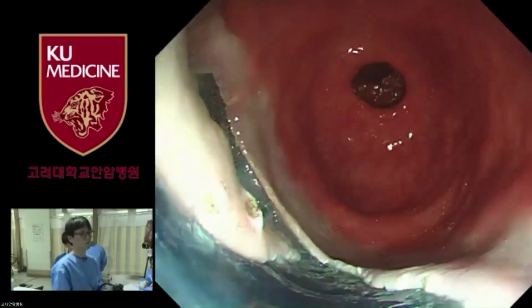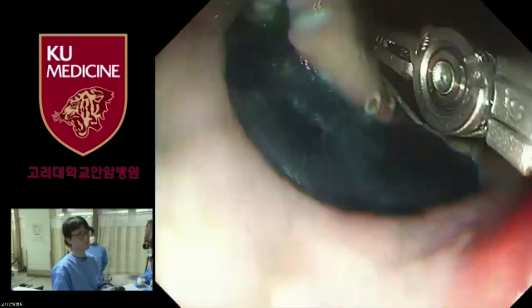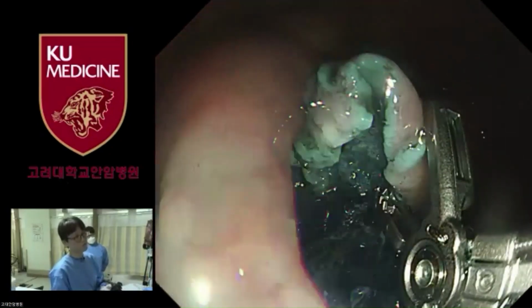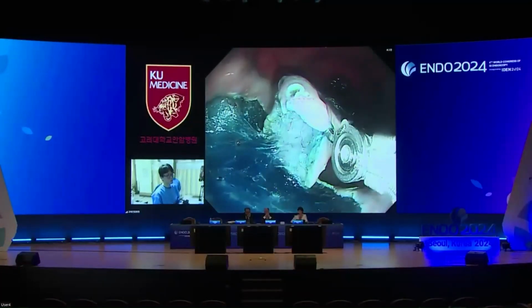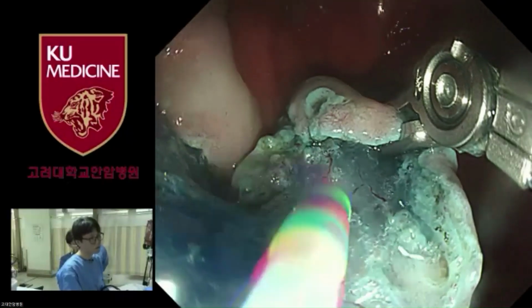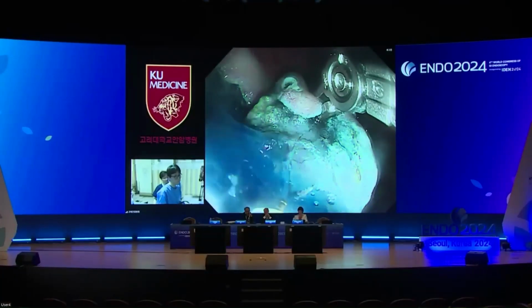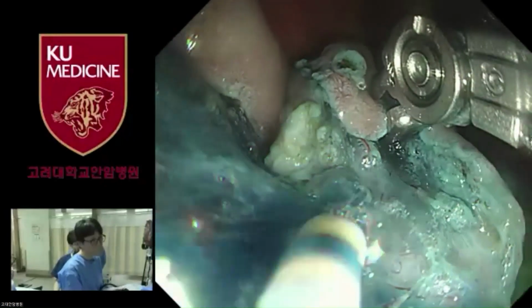And then if we use this robotic device, we can just grip the tip of the flap, and then lift. And then you can see the whole operation field of the submucosal layer. So if there is a bleeding vessel underneath here, we can find it and treat it. That's nice. So that's quite a good advantage when we're doing this kind of procedure.